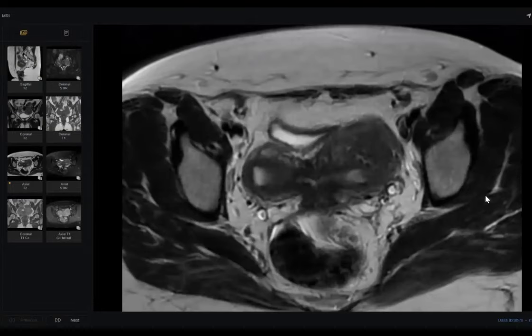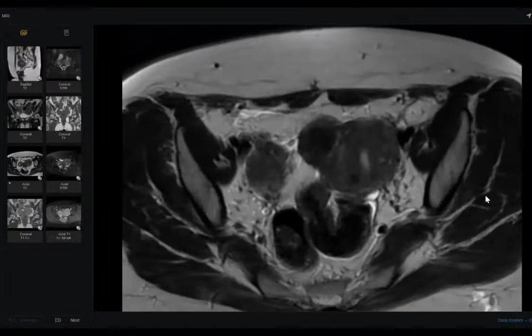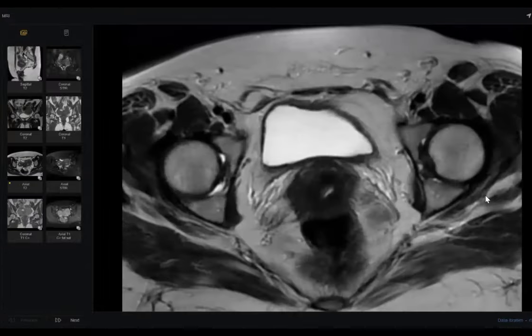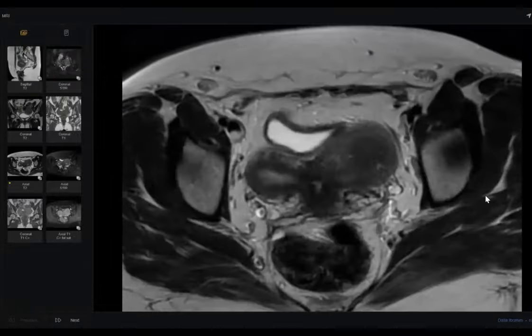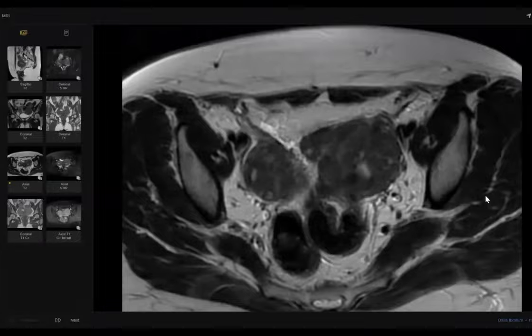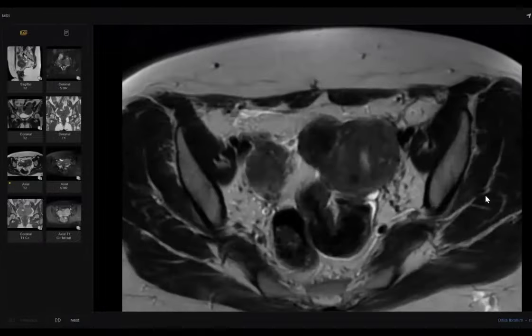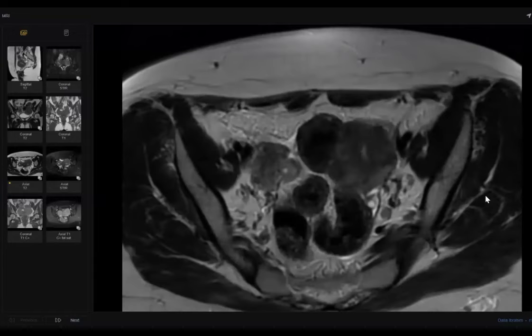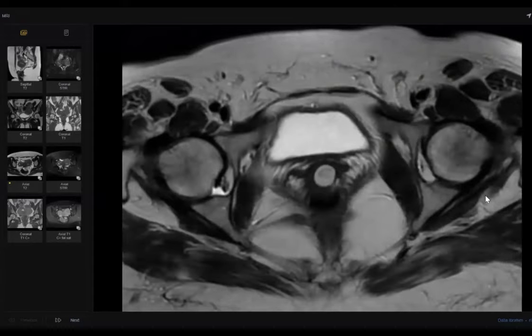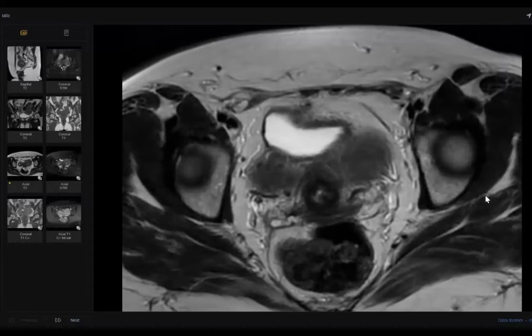So this is the uterus with normal thickness. Okay, so here it is apparent that the uterine cavity is actually divided. So it's probably not fibroids. The uterine cavity is divided, a heart-shaped uterine cavity. So it seems like this is a congenital malformation of the uterus. The two ovaries are seen fine. There is one cervix with a cervical cyst probably, and then the uterine cavities are divided.